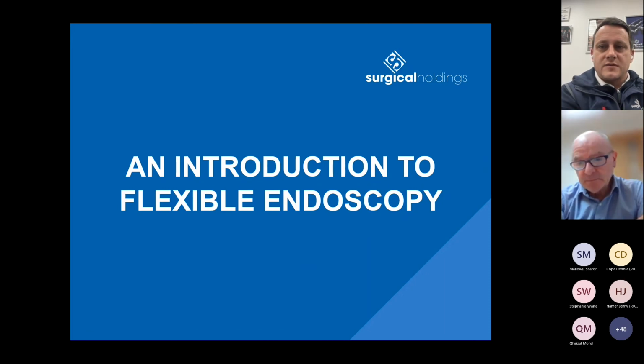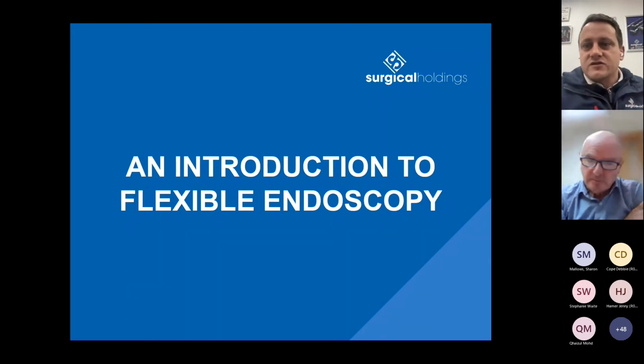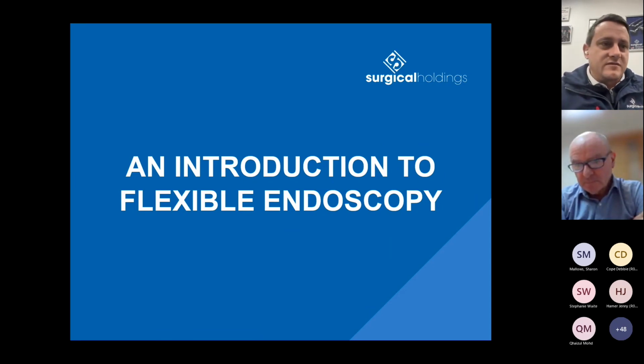Yeah. A couple of comments have just come in. Gemma has just mentioned that she was at a conference yesterday with ASP, who I gather are a sterilising company, and they've got a low temperature sterilisation for rigid and semi-rigid scopes, and they're coming up with a solution for GI, hopefully in the near future, using hydrogen peroxide and plasma, which would hopefully be a solution to water ingress. Obviously taking away the risk would improve the situation, I guess.